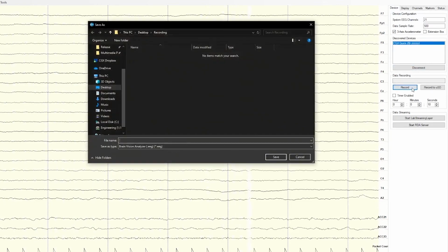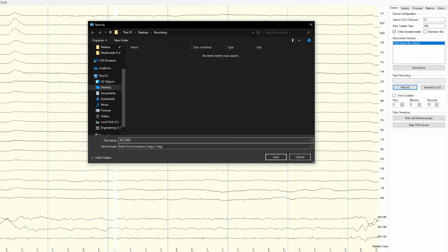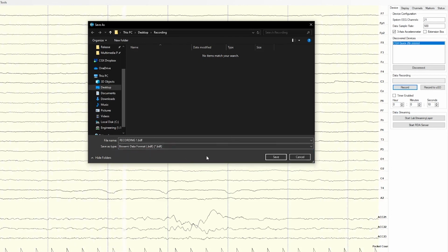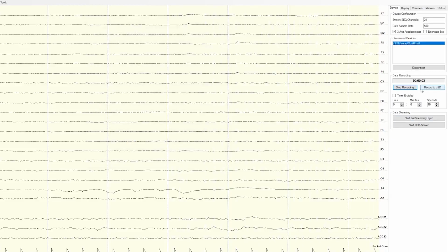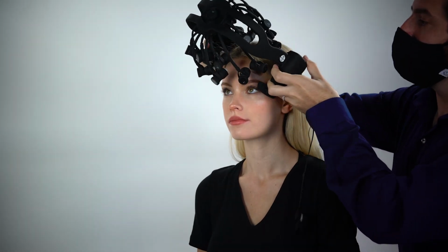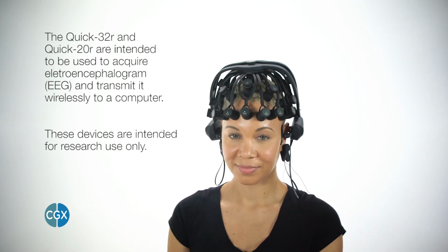Recording. After you have acceptable impedance levels, navigate to the Device tab and click Record to begin recording. Enter a file name. Choose your recording format: EDF, BDF, EEG, LAY, or text. To end the recording, click Stop Recording. Press the power button once to turn off the headset and place the headset in the carrying case when not in use. For additional information on your recordings, including anomalies, download a Quick Series user manual.